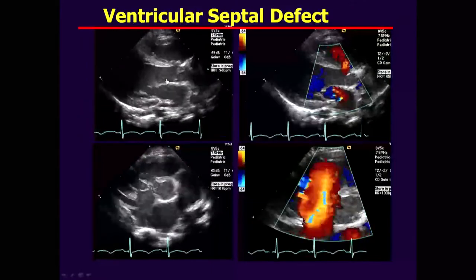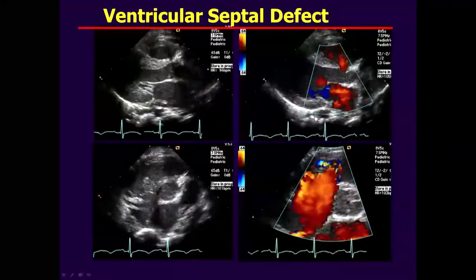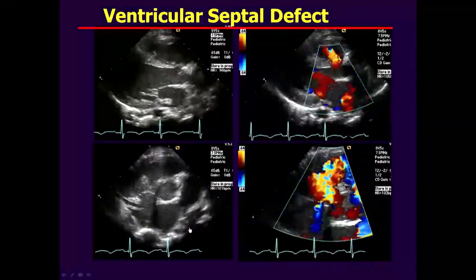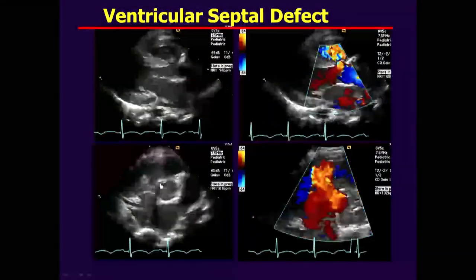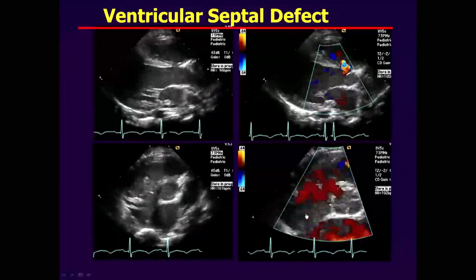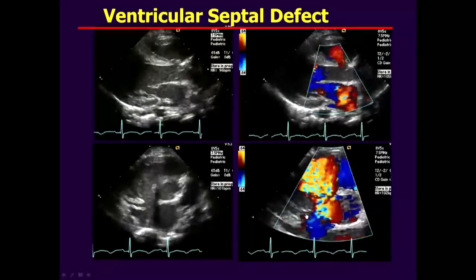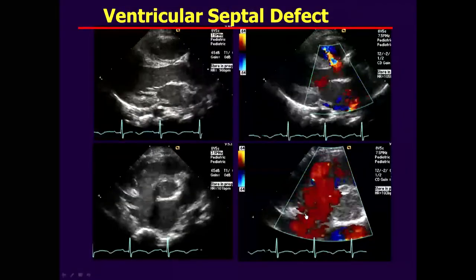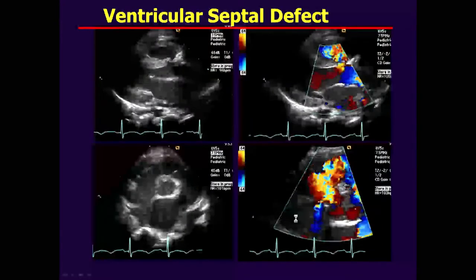You can notice the long axis view. All the septum is here, and here is a shunt, so left to right. And then we can rotate clockwise to the short axis view. Here is the tricuspid valve, and near there the defect is there, and the shunt is there. So this kind of VSD we call perimembranous. Perimembranous VSD is located just under the great vessels, with the mitral and tricuspid valve above that. So a very, very thin membrane, we call that the perimembranous portion.